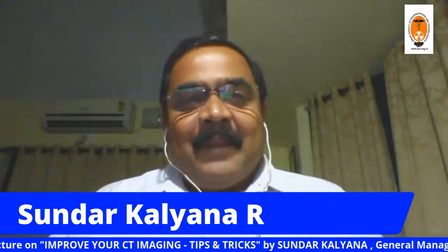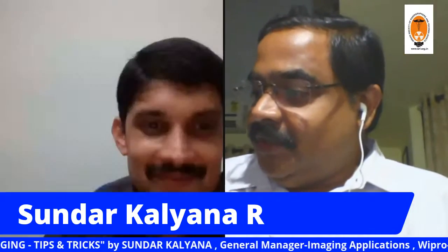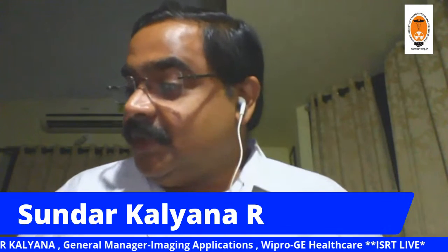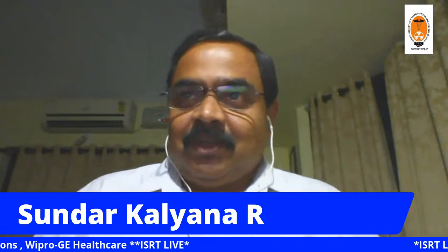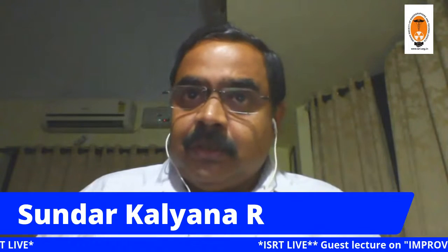And Sanjeev's question also, Mahesh, I can answer. The question is care dose versus fixed kV. Care dose is a technology where you are using mA modulation.